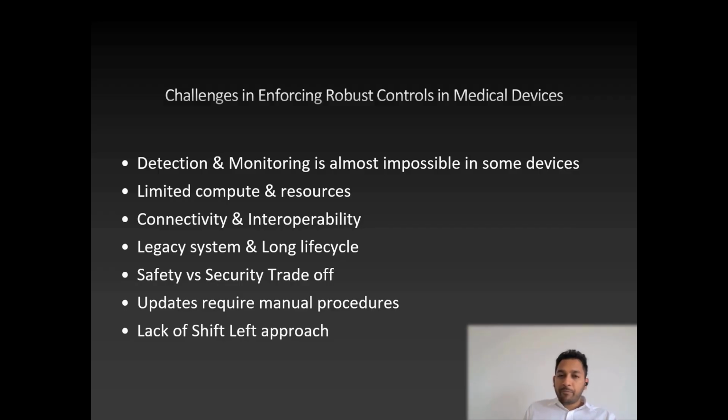The other problem is that sometimes these devices run on very low computing power, so they don't have proper resources. Thanks to cryptographic accelerators, this problem is slowly going away, but it still exists in old devices. And as I said earlier, with no network connection, it's also very hard to push software and security patches, even if you find vulnerabilities. Some devices are decades old, so security was not a thing when they were building the system. Introducing security now will create a lot of financial and logistic problems.